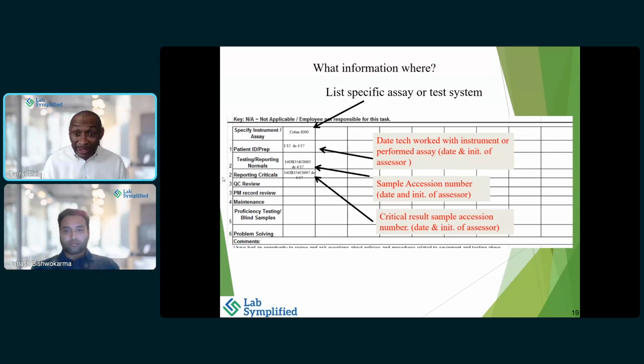I know there are some expensive tests out there, like fetal fibronectin is a very expensive test, but you really can't group it with any other test. It still is a non-waived test. You have to do competency assessment. There are some that I've talked to CMS and CAP about where they can use a representative, so you don't have to use a fresh cartridge. You can use the QC material. That is a conversation you need to have with your medical director, so you can have an inspector come and you can explain why there's a high cost if you want to do a fresh test every time for the competency. Sometimes that's unreasonable. Some tests can get up to $1,000 per test. So be prepared to explain it.